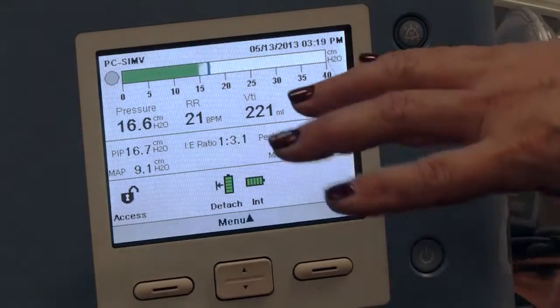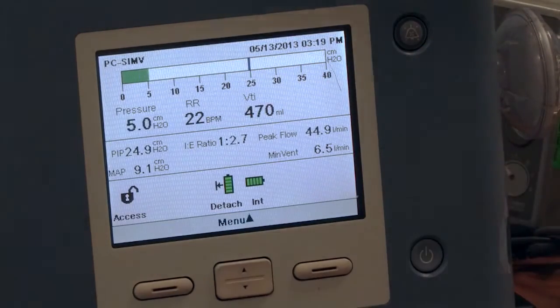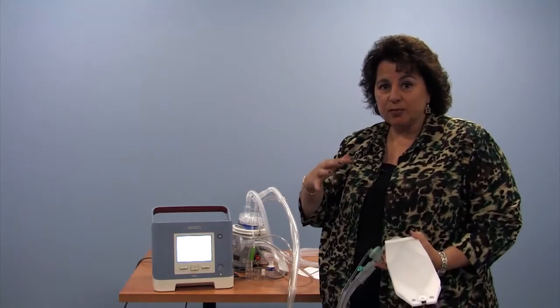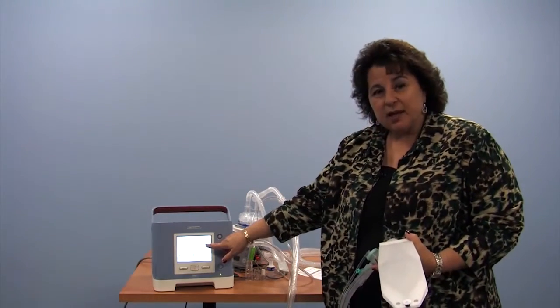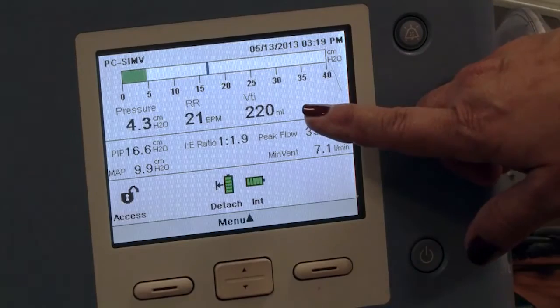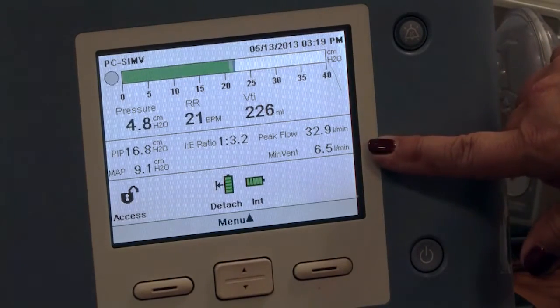And remember, we have breath sizes that are around 400 cc's of air. So think of a 1 liter bottle of seltzer. Half of that, or a little less than half of that, is the size of your child's breath when they receive the 470 or 480 cc breath. And then the pressure support breaths are a little bit less. They're in the 200s we see here. So that comes out to the 6.6 liters.